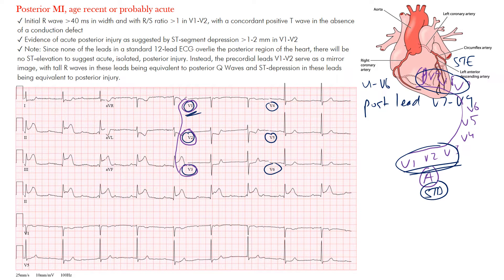If you look at the EKG here, in V1 there's not much ST depression, but in V2 it's clearly there — almost an upsloping ST depression, and here's a flat ST segment depression. Notice the R waves occurring there. You might say these are normal R waves, and maybe the one in V3 is normal with R wave progression. But if you have deep R waves, think of those big R waves as almost equivalent to Q waves.